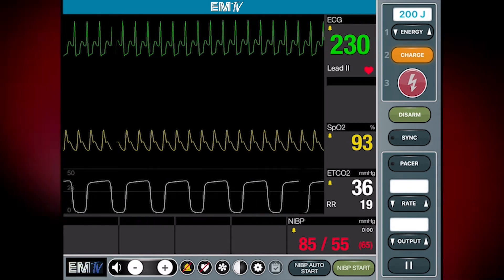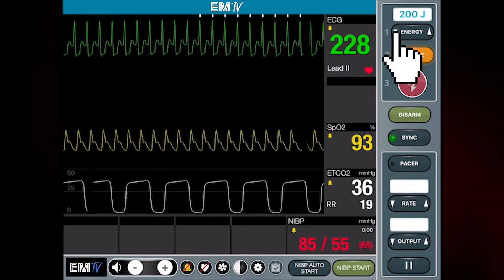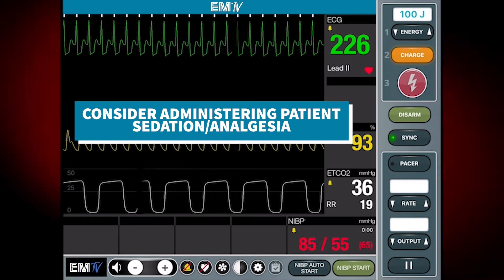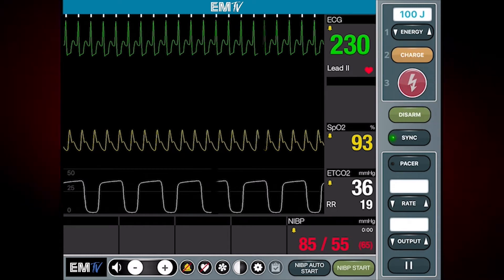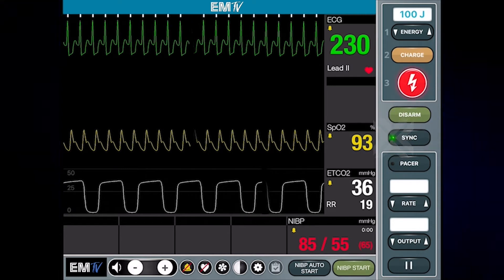First thing I'll do is hit the sync button. I'll then select an appropriate energy setting. I'll then press charge while assuring that the sync button remains lit. Make sure everyone is clear of the patient and press and hold the shock button to deliver the energy.